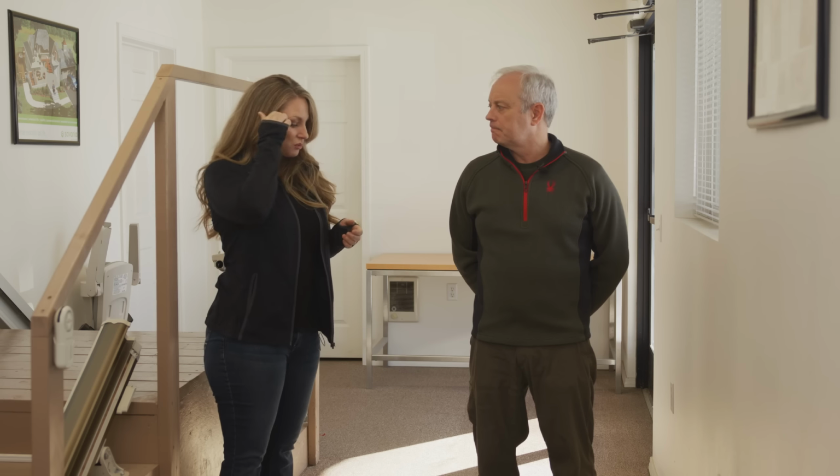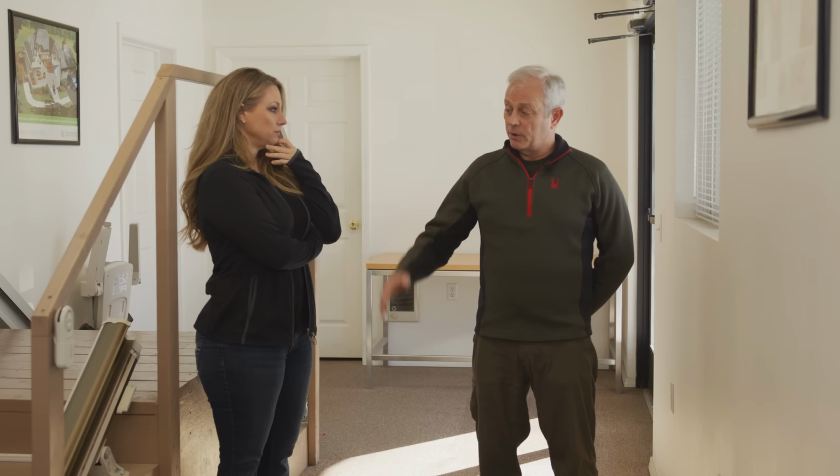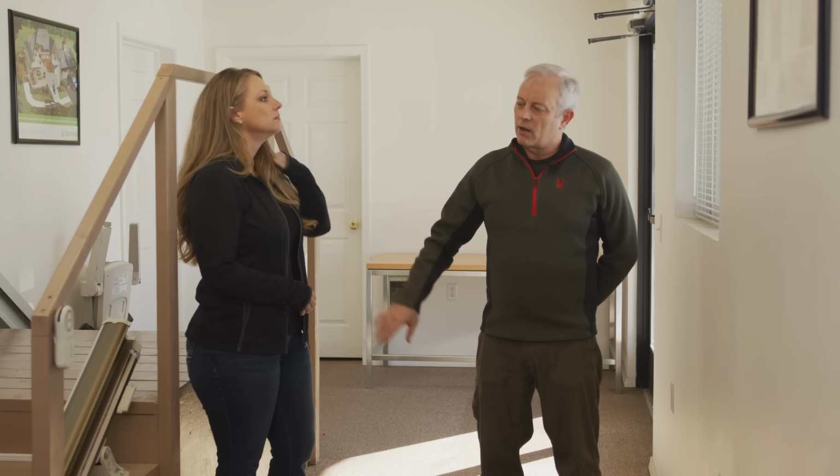So since you've been doing this for 25 years, what is something that you mentioned earlier to me that families don't know what they don't know? And that's why we're having this video today. That's correct. What are some of the things you've noticed that they don't know to ask? Well, a lot of people don't even know about lifts like stair lifts and what they can do. They all think they're mounted to the wall as an example. They don't realize that open staircases are just as viable as one with a wall on the side. So that's a common issue.